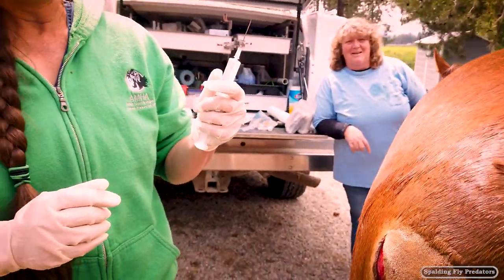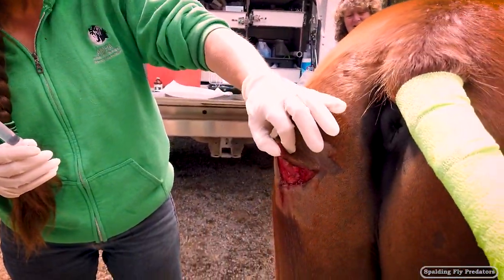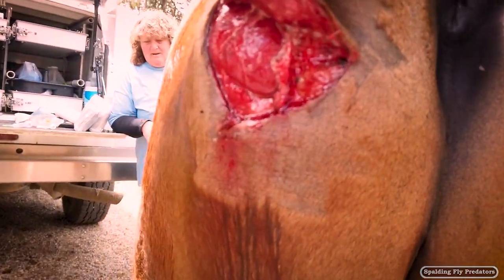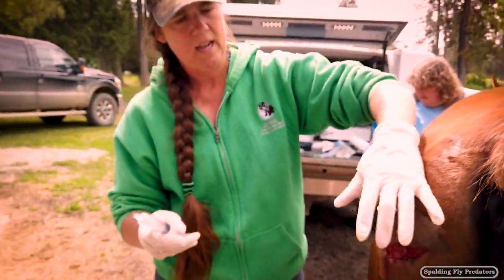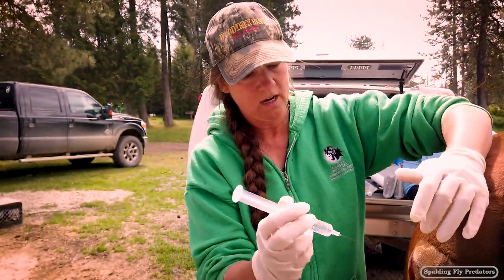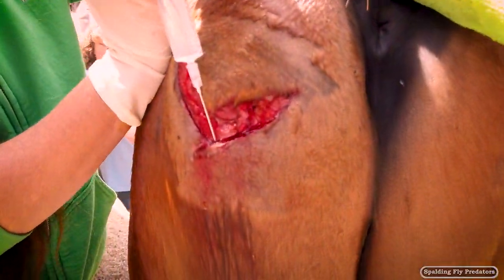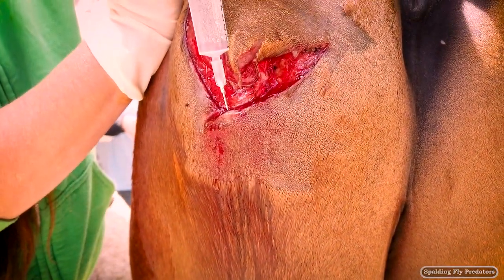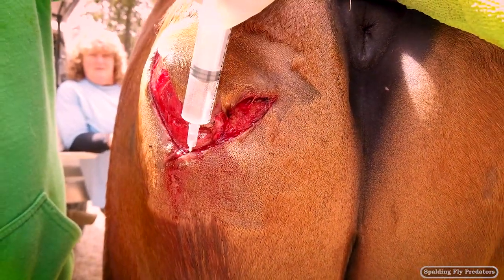Of course, it will get hurt on the strangest of things. He's got a nice little flap — very little damage to the muscle, but a full thickness flap for sure. So we're going to put tension-relieving sutures on the side and do a little drain here. We've already cleaned it up pretty well. I'm just going to do a little bit more lidocaine for the block to put this drain in, because the drain is going to come out right about here. I'm going to infuse that area with lidocaine.